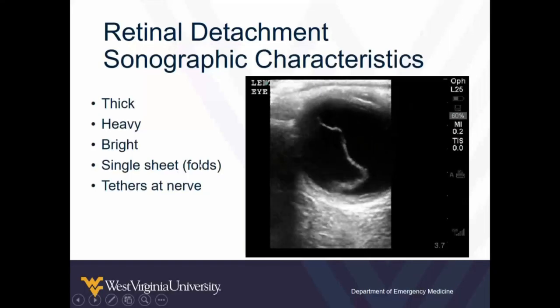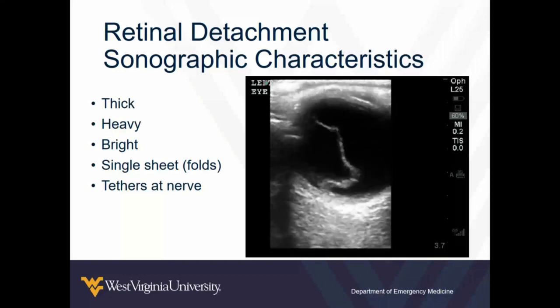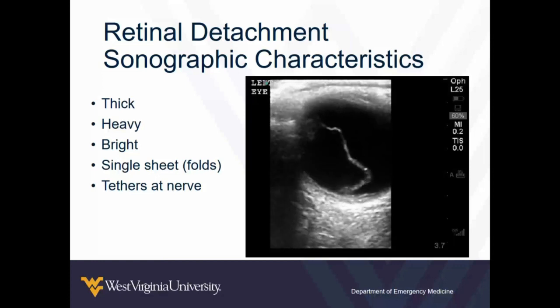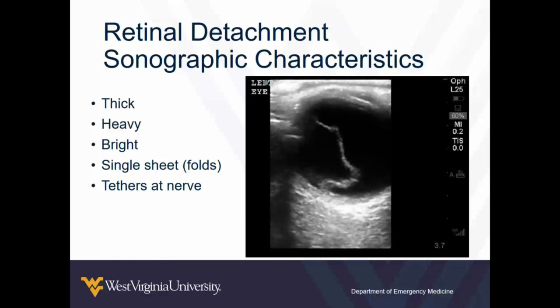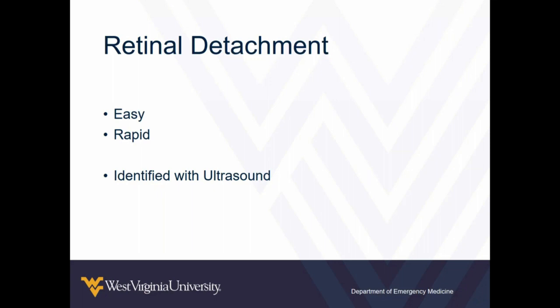There are things that can look similar that you need to differentiate. The retina is a thick layer of tissue — it's heavy, so it often tends to lay in a dependent area. It's very bright, and it's a single sheet; it may have folds in it but it doesn't have branches. And if you follow it, it will usually tether at the nerve. So those are going to be important characteristics to differentiate retinal detachment from other things. This is a diagnosis you can easily and rapidly make — you can find it with ultrasound more quickly than by physical exam or other means.